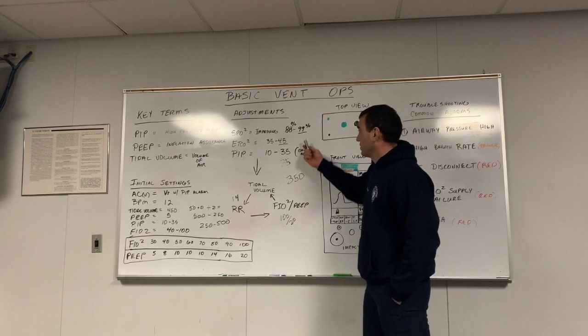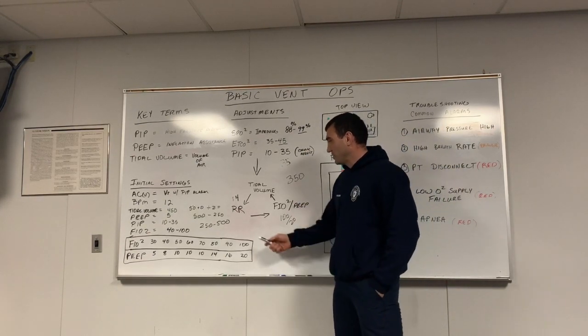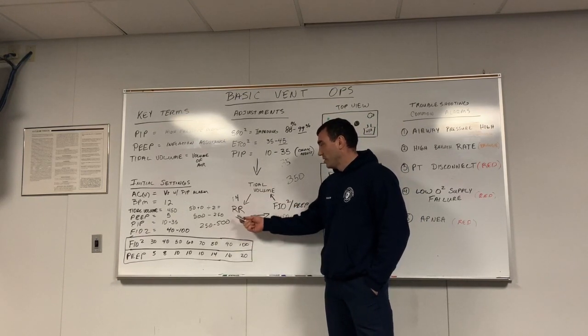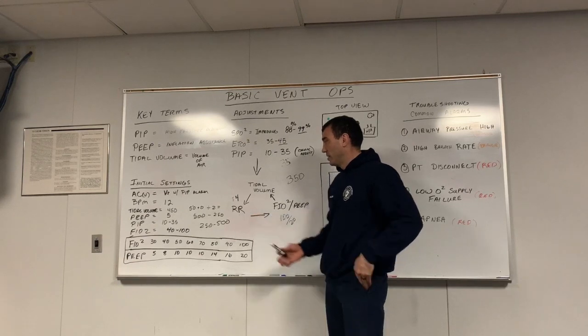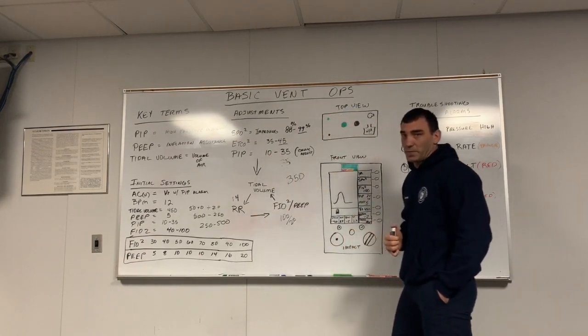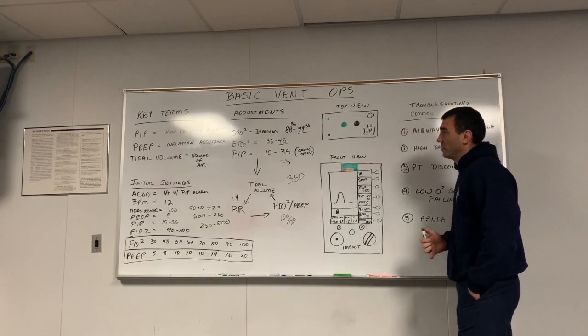After I check my SpO2, I'm like, okay, I'm cool. Everything's working great. Patient likes it. All my alarm settings are great. I made an adjustment to the respiratory rate. So after that, I need to pay attention to my end-tidal CO2 and make sure that I'm not hyperventilating the patient. This is just something to think about.